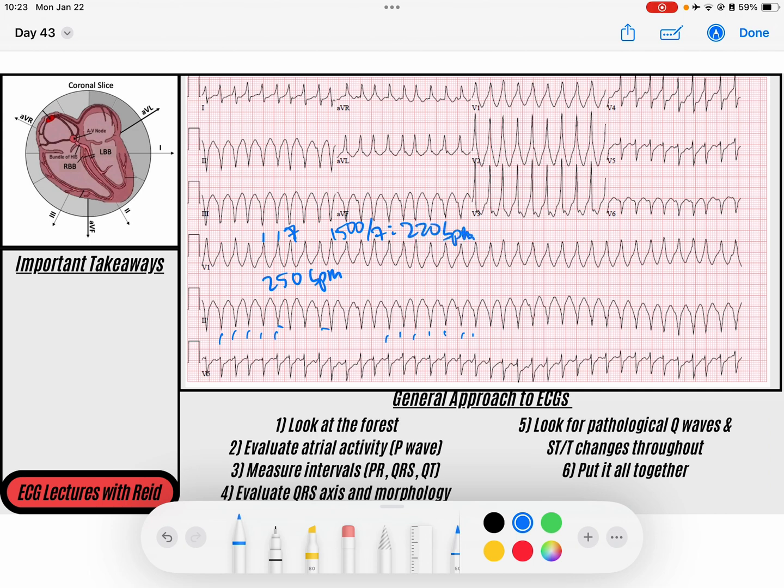So we've got a tachycardia and we would call this a wide complex tachycardia. I don't see those nice sharp QRSs that we like to see in our normal AV node conduction.